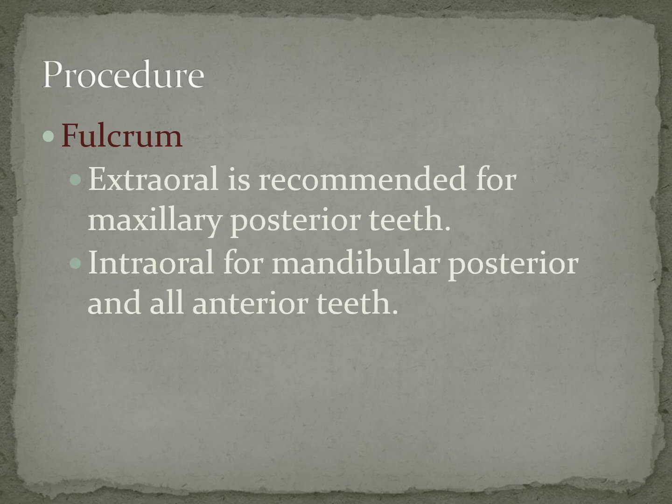As far as fulcrums, extraoral is going to be recommended for the maxillary posterior teeth, intraoral for mandibular posterior and all of the anterior teeth. And I'll go over some fulcrums with you guys when we do a demo, but they're pretty similar to your fundamental fulcrums as well.